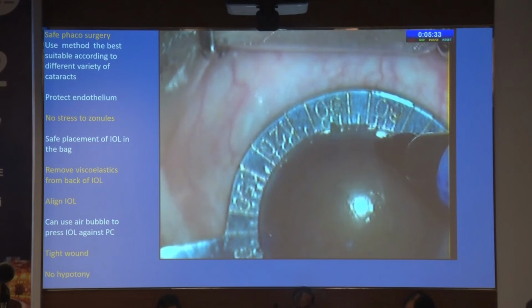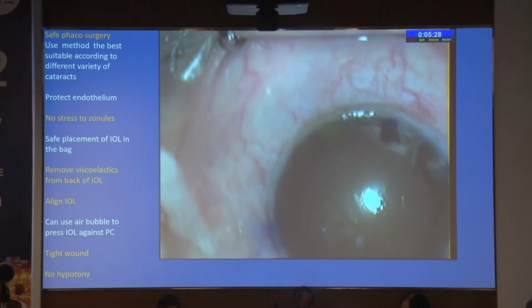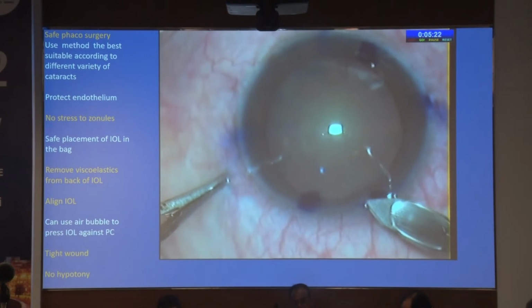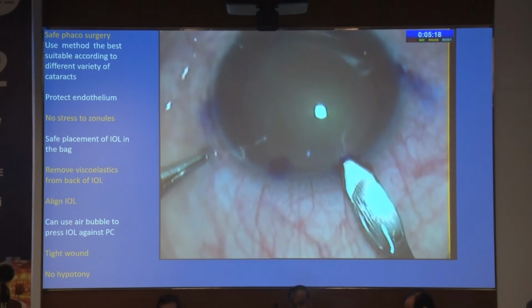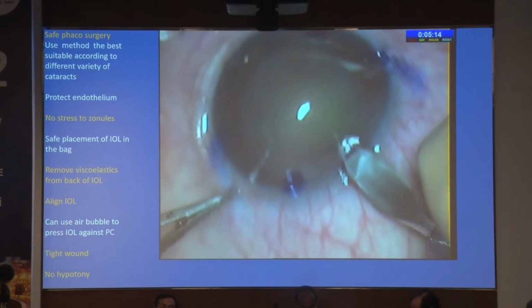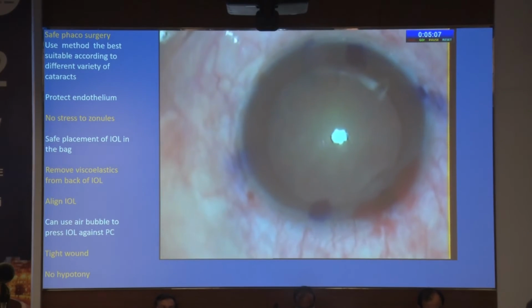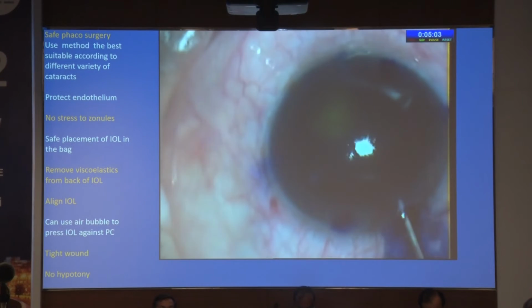The only thing is that you have to take the axis where the IOL has to be aligned, and the reference marking has to be good. Rest everything is practically the same as a normal phaco. So never hesitate to do toric IOL as if it is a kind of fear for you. It has to be done like a normal phaco. These markings have to be very perfect.